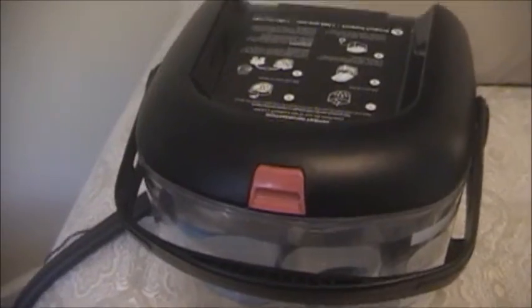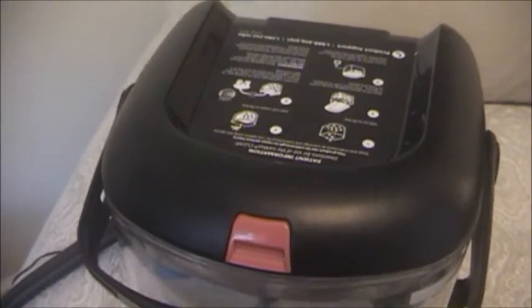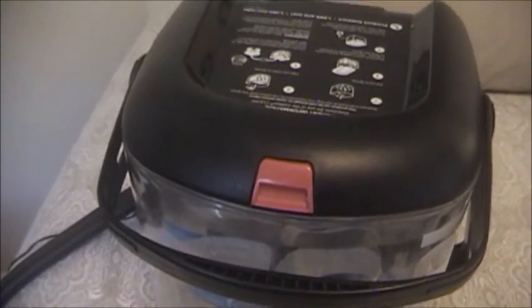It just sits there. Now, they told my mom that she needs to do this for about 20 minutes every 2 or 3 hours. To be perfectly honest, she does it a little bit longer than that. I'd say she does about every 3 or 4 hours. So not as often, but she ices it for about 30 to 40 minutes. And I found that you really need to do it that long to get the swelling down.